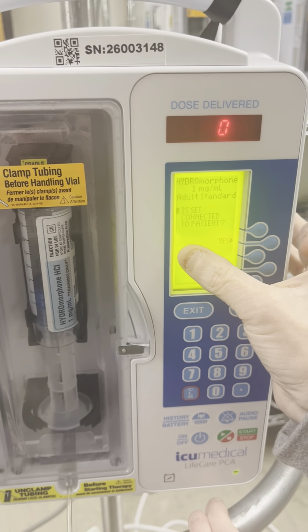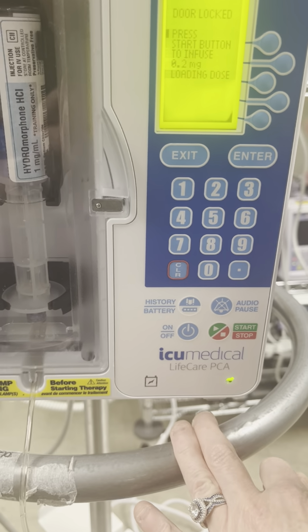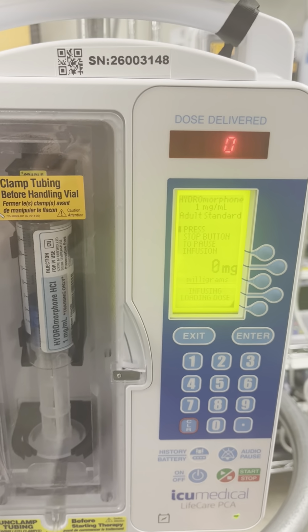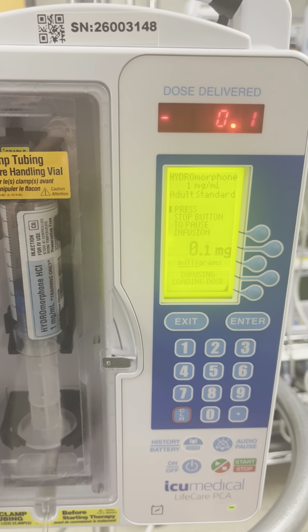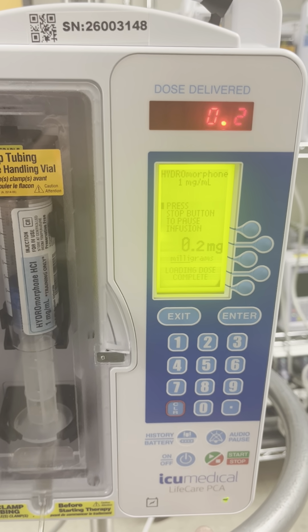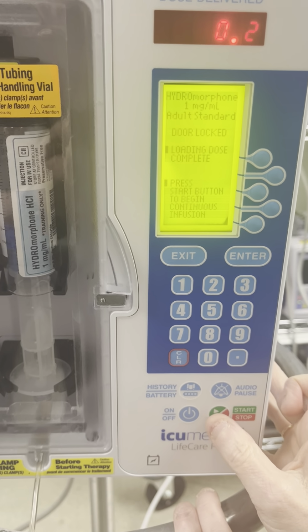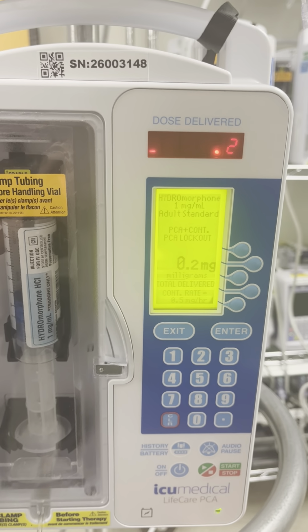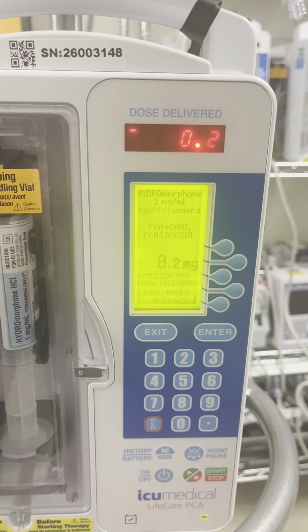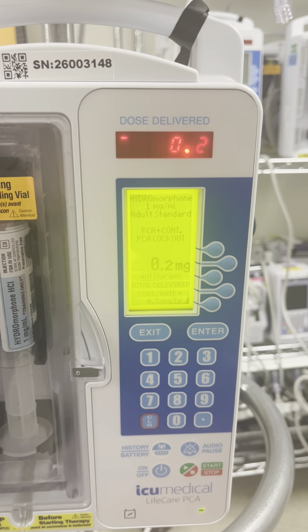Once you've confirmed that you're actually connected to the patient, hit yes. Then on the bottom, you hit start. There you go, hit start. And your medication should begin infusing your loading dose. Once your loading dose has infused, the machine will ask you to start your continuous infusion, so you need to just hit start again. And your patient has your continuous medication infusing with the addition of additional bolus in 15 minutes.